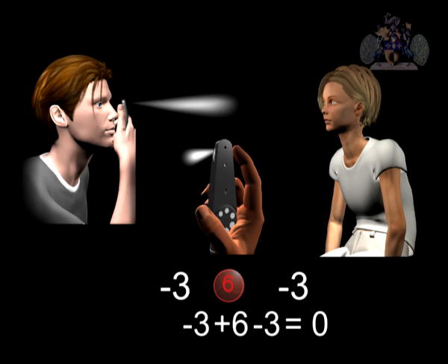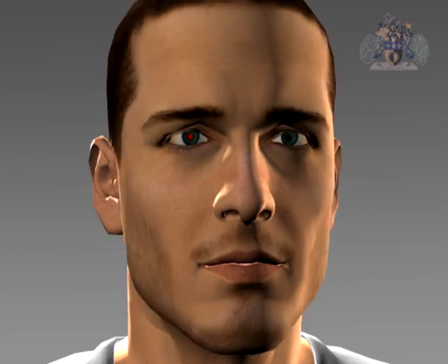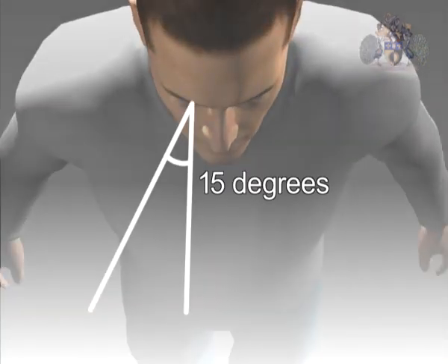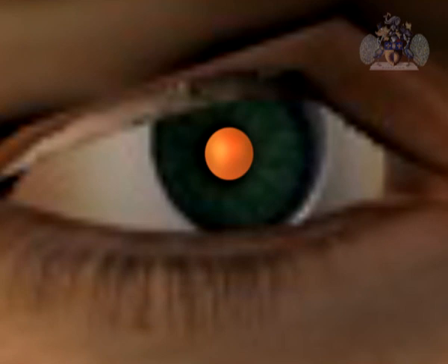It is often the case that the patient is unaware of the strength of their spectacles. This is where it is important to get one's position right, so that despite the fact that the image is blurred, if the examiner is in the right position at 15 degrees to the nose on the horizontal plane, then the view is bound to be that of the optic nerve, however blurred this may be.